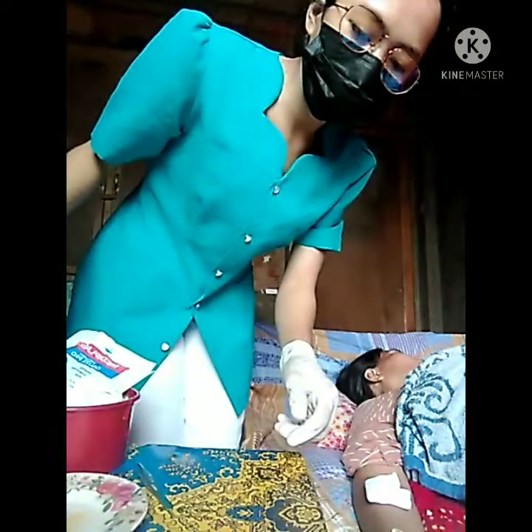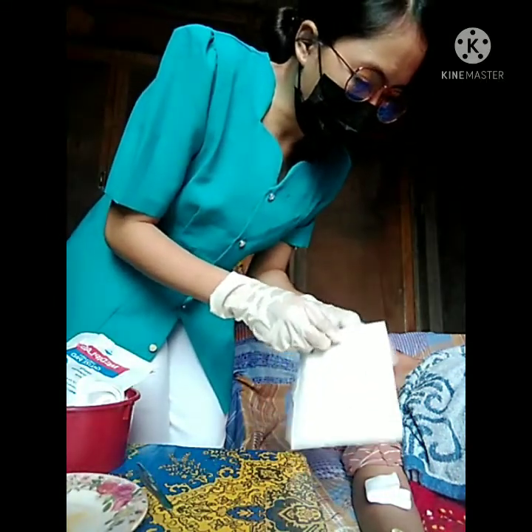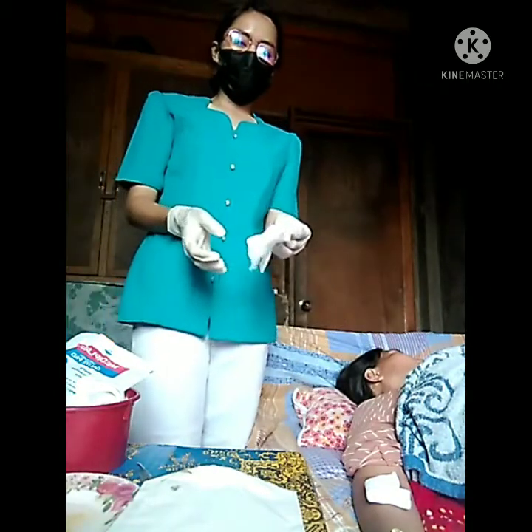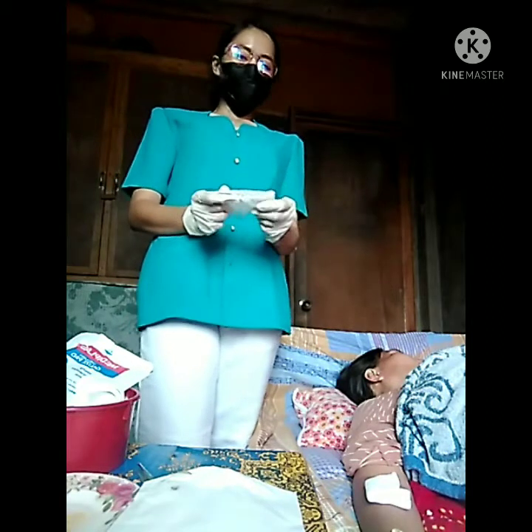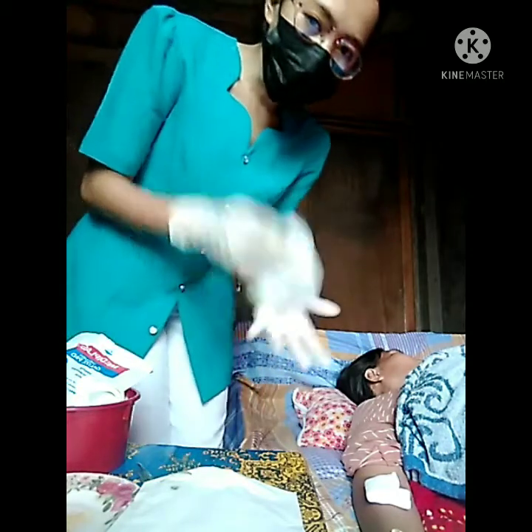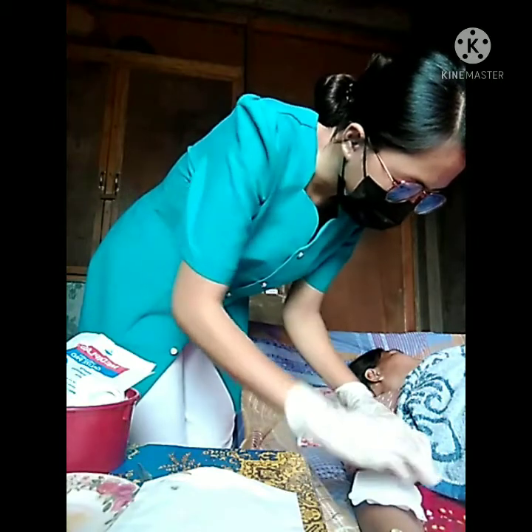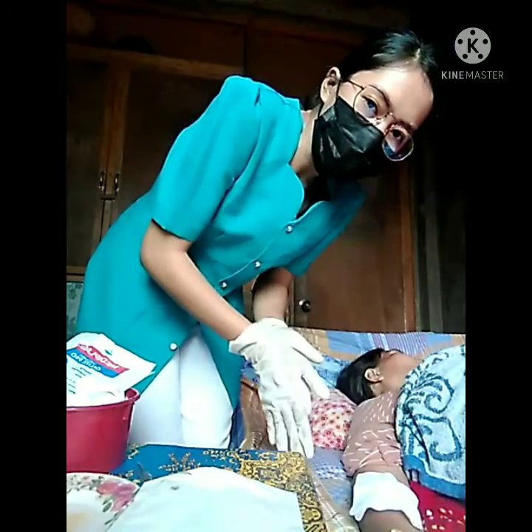And then also cut a 4x4 gauze flat, to fit around the drain if present. This gauze is size 4x4, so I want to cut this, then put it, and then pre-cut the gauze if available.